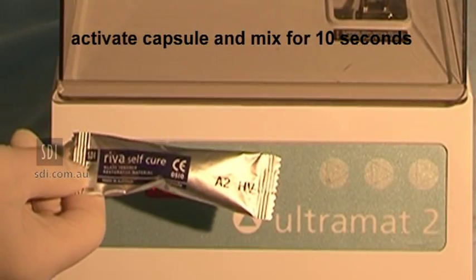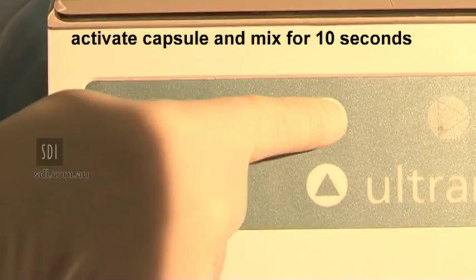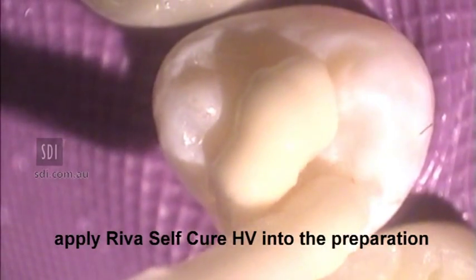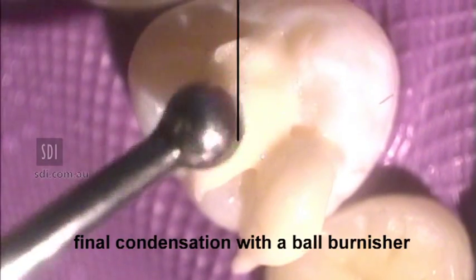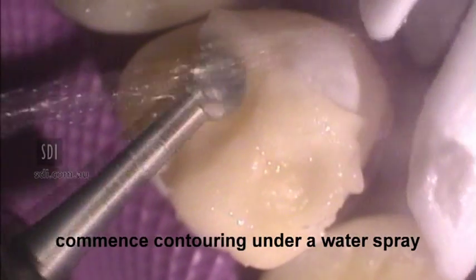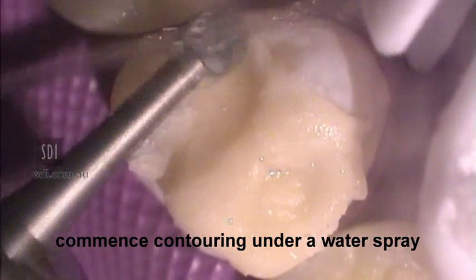Activate Reva SC-HV capsule and mix for 10 seconds. Apply Reva SC-HV to preparation and commence condensing with a ball burnisher. After setting, start contouring with a slow speed burr under a water spray.